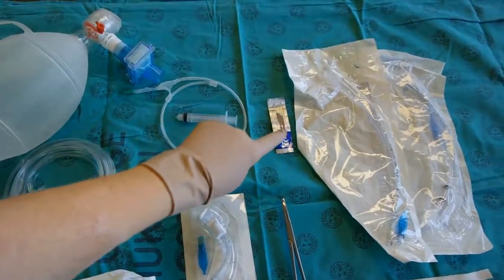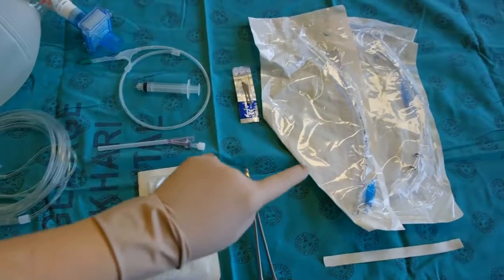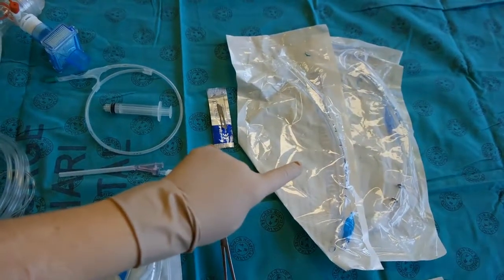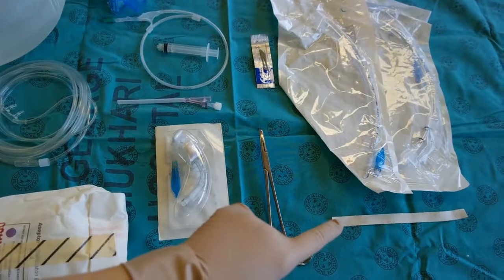needle and guide wire, a size 10 blade, a small curved artery forceps or hemostat, a small endotracheal tube size 5 or 6, or alternatively a small tracheostomy tube, and some tape to secure.